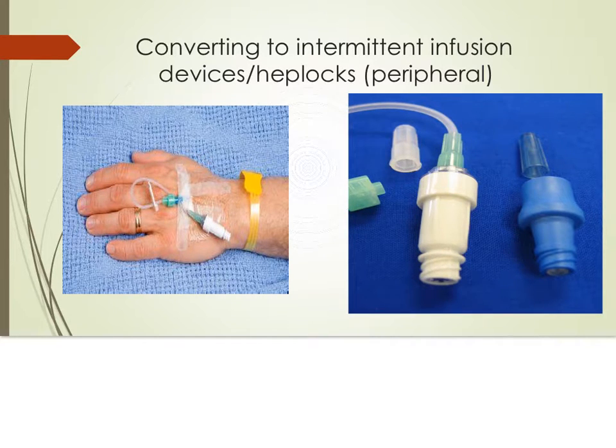If the tubing were to be removed, the cannula would bleed, and microorganisms could directly enter the bloodstream. A properly used intermittent infusion device prevents both of these complications. First, as always, check your physician's orders and facility policy. Next, wash your hands and prepare your equipment.